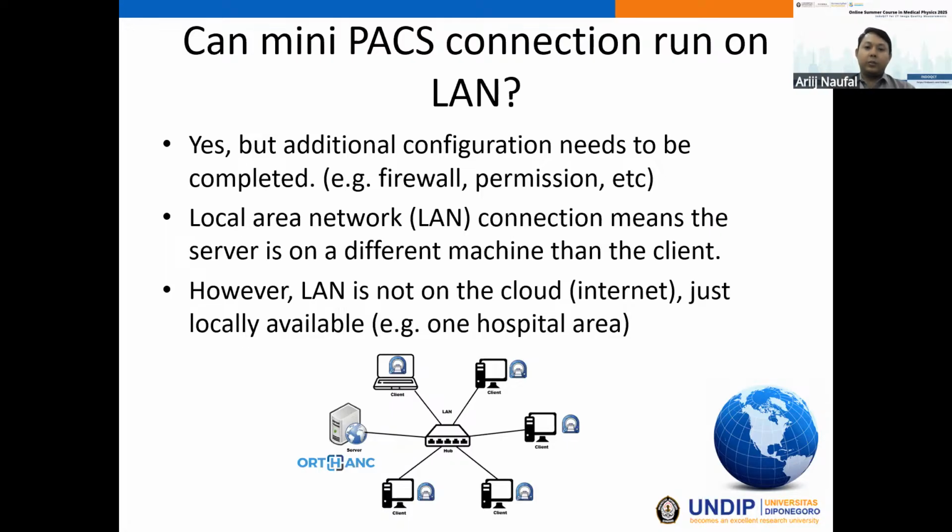And also, please keep in mind, LAN connection is not on the cloud. It means it cannot be accessed from outside the intended network. So it is just locally available, for example, in one hospital area or in one building that has the same LAN connection. So this is the illustration.